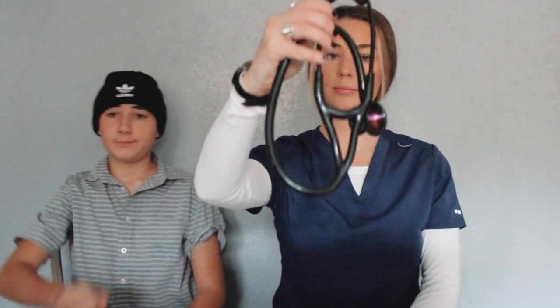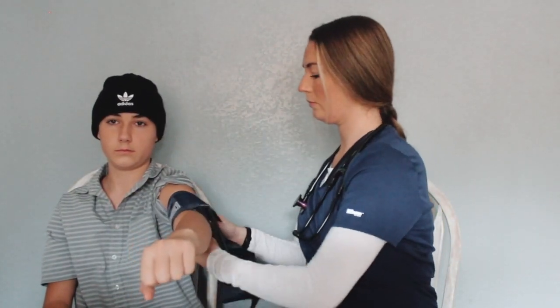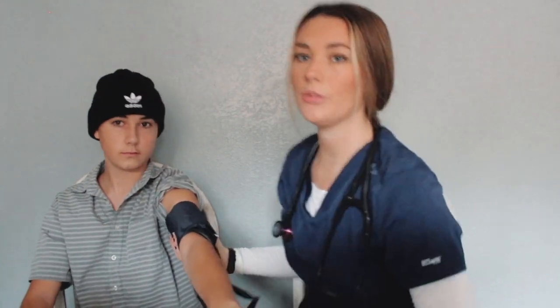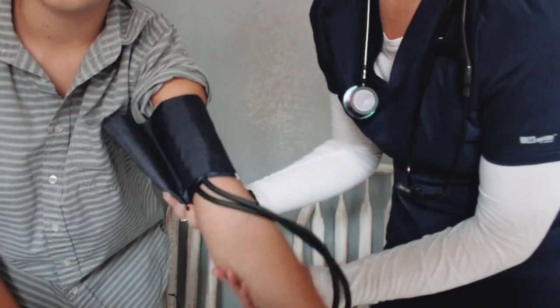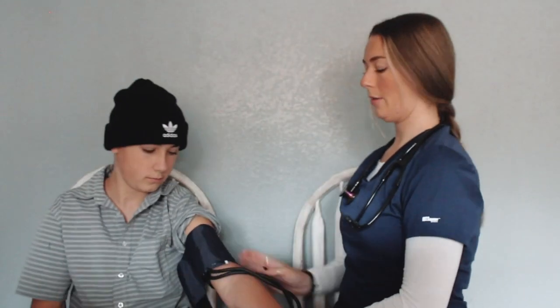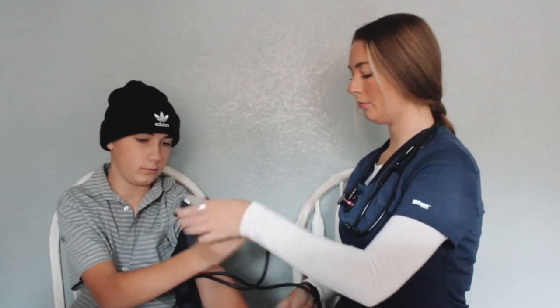Time to take blood pressure. To complete this skill, you will need a stethoscope and a blood pressure cuff, also known as a sphygmomanometer. The first thing we will do is place the blood pressure cuff on our patient's upper arm. Be sure to align the artery side properly with the arteries of the arm. Next, with our index and middle finger, we will feel for the brachial pulse, which will be in the fold of the elbow medially to the patient. This may take some time, and you may notice the location of a person's brachial pulse may slightly vary on each person's arm. We want to feel the strongest pulse point. Before taking blood pressure, we want to make sure our blood pressure cuff is on the unaffected side, if there is an affected side of the patient. We need to make sure our patient's legs are uncrossed, that they are sitting up straight, and lastly, that we are supporting their elbow at heart level.